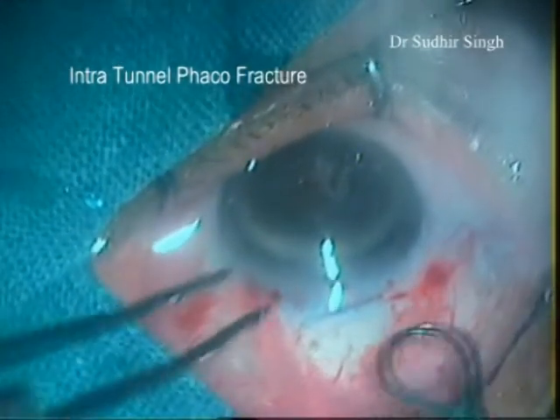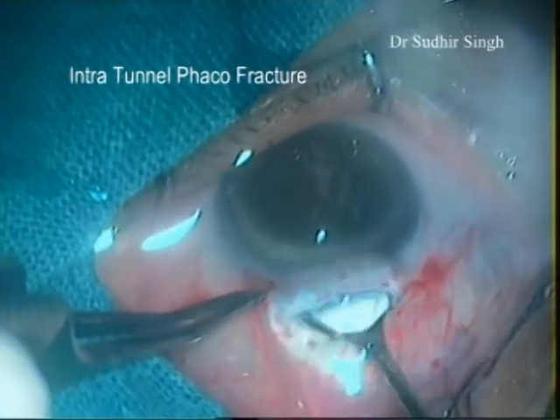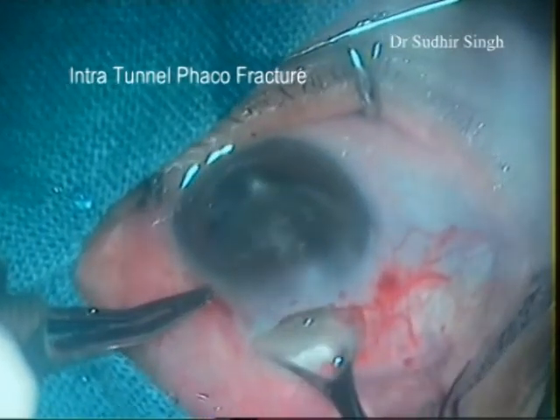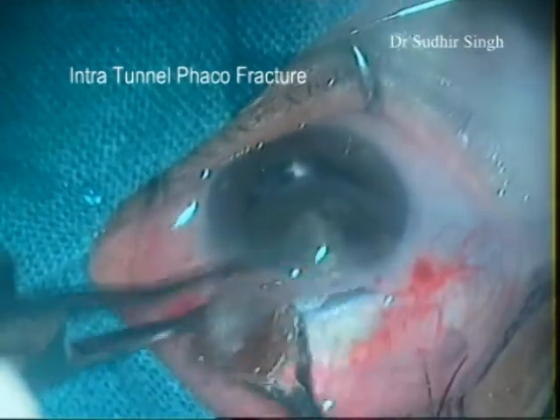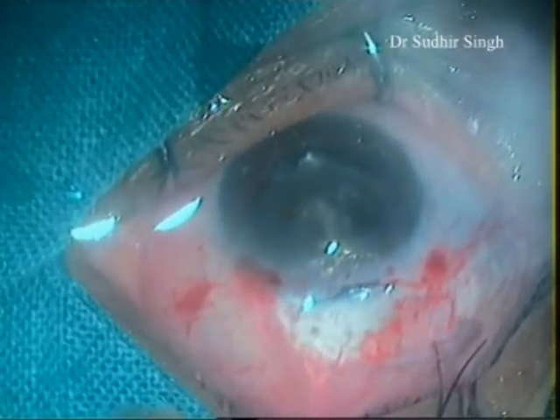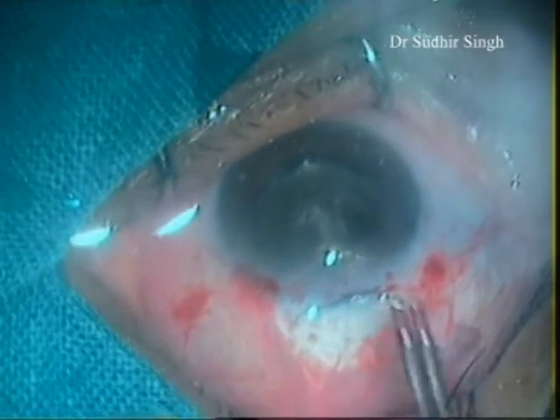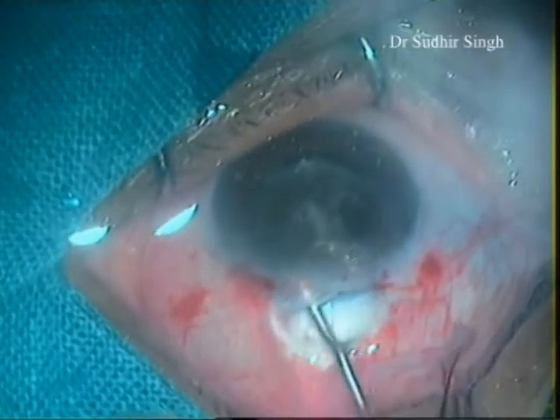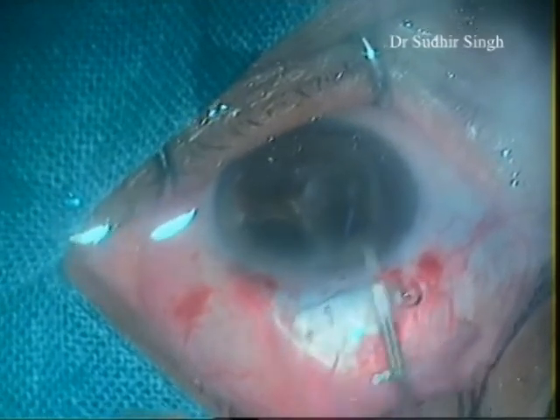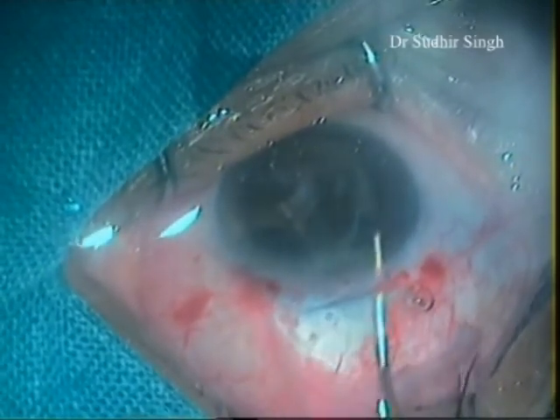The nucleus is engaged in the lens loop and slowly withdrawn from the anterior chamber while the posterior lip of the tunnel is depressed. When the nucleus gets engaged in the tunnel, the vectis is pulled posteriorly and upwards. This causes breaking and removal of a part of the nucleus, and the other part remains engaged in the tunnel. The engaged part of the nucleus is pushed back into the anterior chamber and rotated so its longitudinal axis coincides with the longitudinal axis of the tunnel.